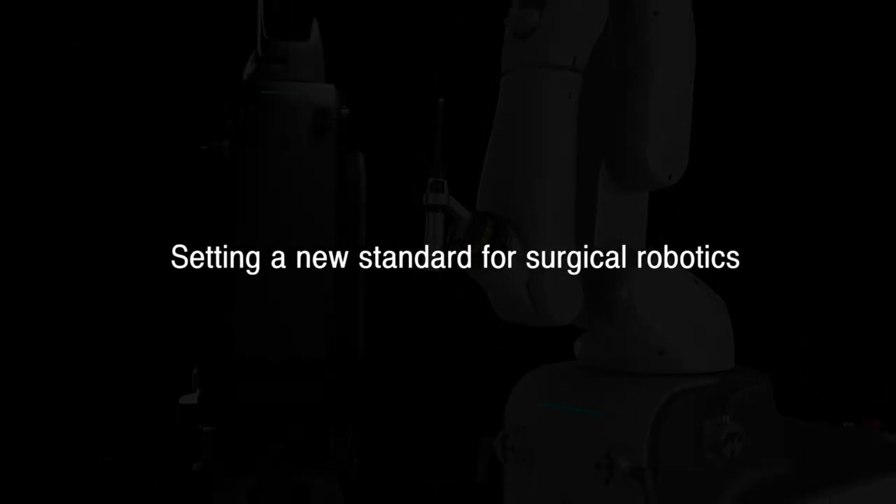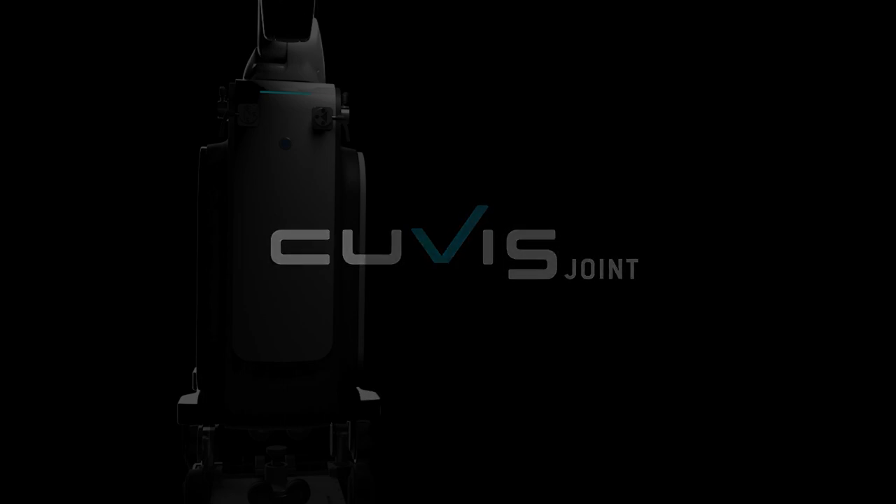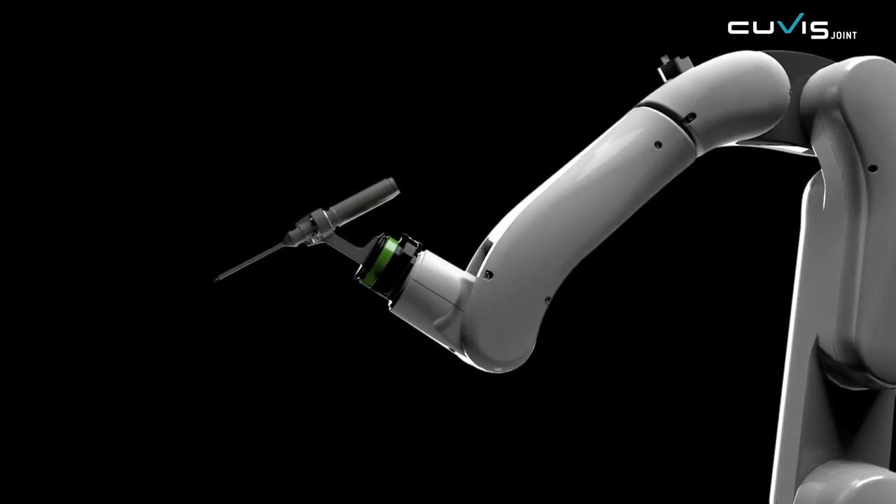Setting a new standard for surgical robots by developing groundbreaking innovations: CUVIS Joint, a user-friendly surgical robot. Flexible, simple, innovative, and easy.